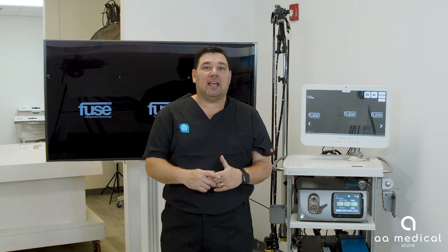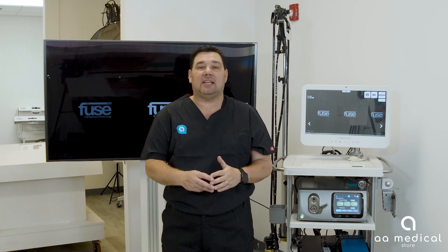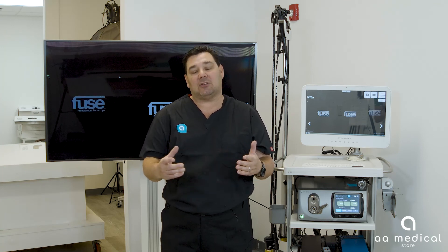Hello everyone, this is Michael with the AA Medical Store. Today we're going to talk about the EndoChoice Fuse system — some features and benefits, and then later on we'll go through the setup and how it actually works.